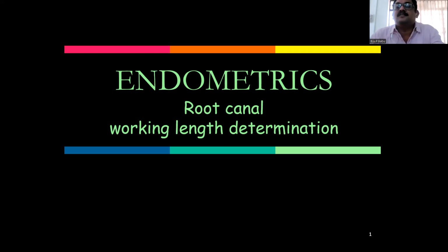Today's class is on endometrics. Endometrics is a terminology used for describing root canal working length determination. So this is a very important topic, very important, because the results of your endodontic treatment depend on the determination of the working length.